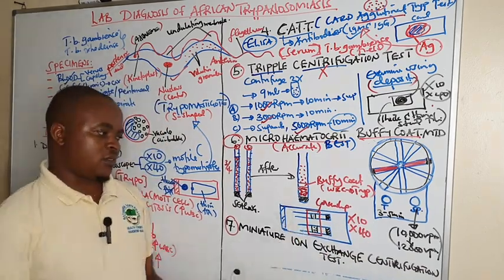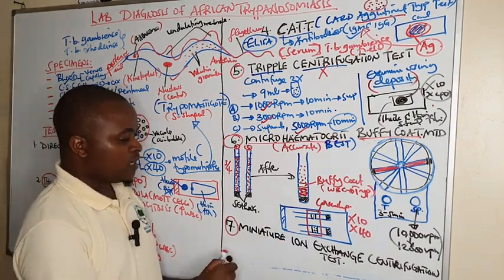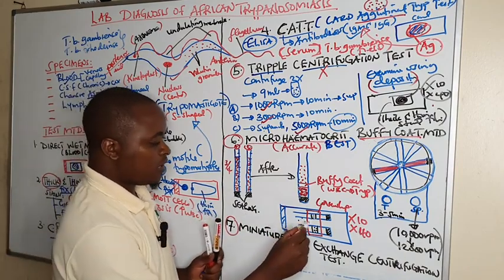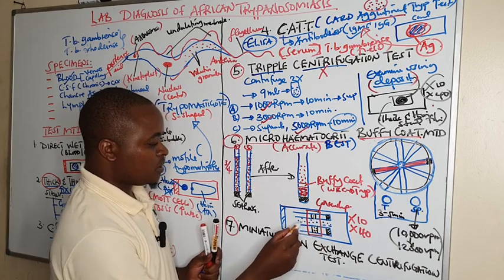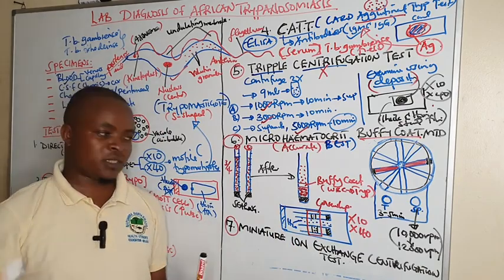But in case, in the procedure they tell us, after orienting them, in the middle we put water. So we put clean water in the middle. So this is water. Then we put a cover slip and examine.